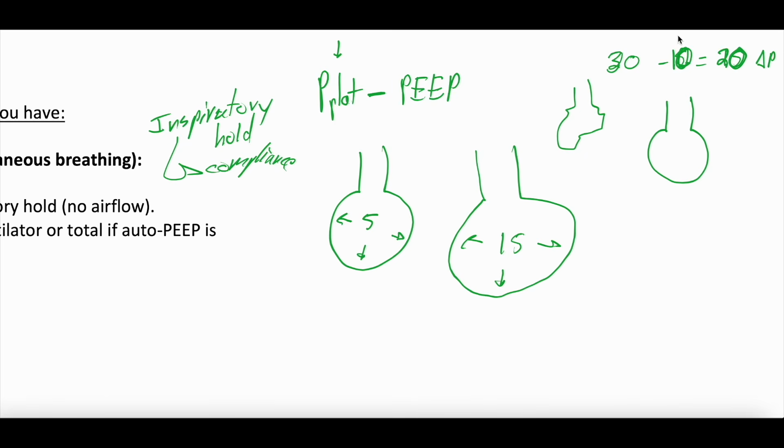So what I'm saying is, I think if I go up on the PEEP, that will cause the alveolus to be perfectly distended, which means that the plateau pressure won't really change, because I'm just going from an underdistended, shriveled down alveolus to a normally distended alveolus. So what this would look like is I increase the PEEP from 10 to 14. And I let that PEEP take hold, and then I check another plateau pressure. And that plateau pressure maybe is 30 again.